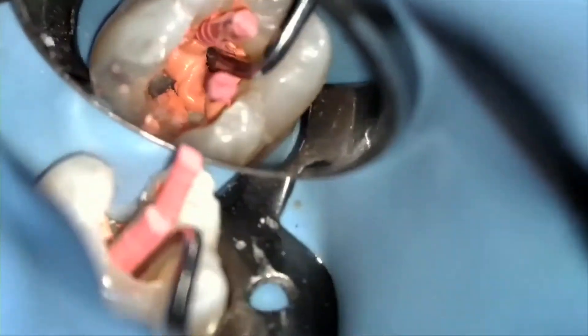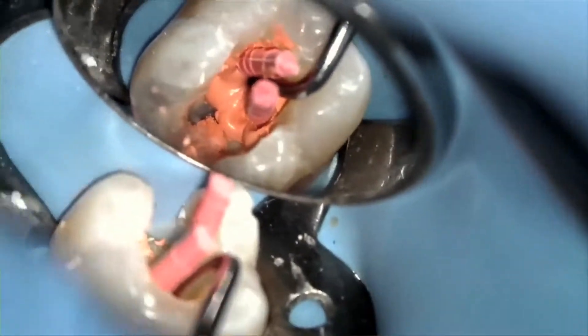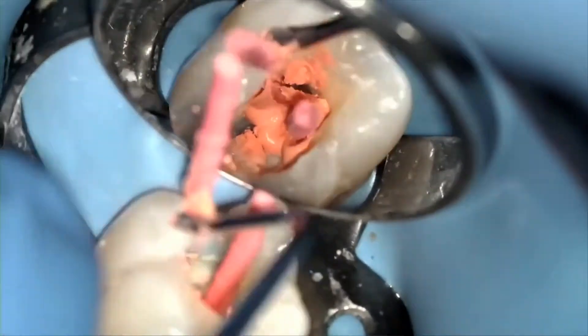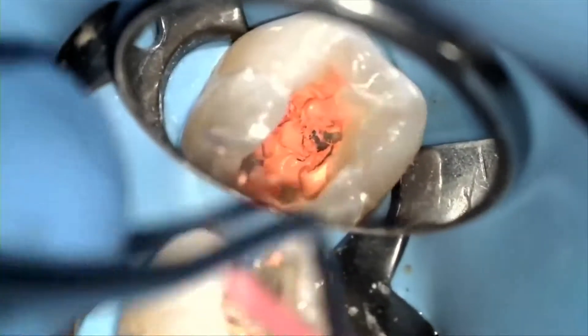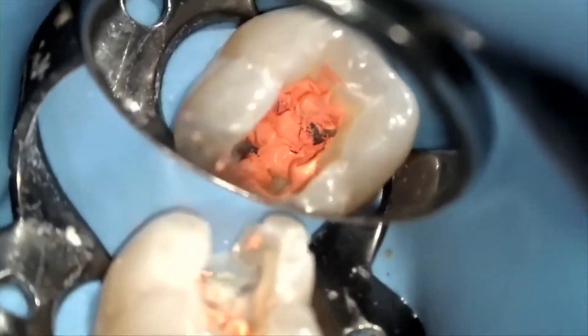To remove the gutta core carrier at the level of the canal orifice, I personally like to use a sharp spoon excavator and sever the gutta core at the canal orifice. As you see in the video clip, you may do this in an apical and lateral direction.